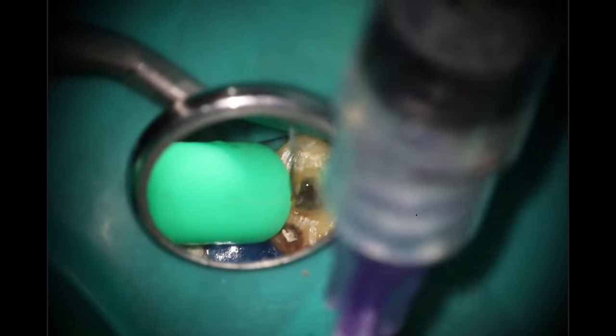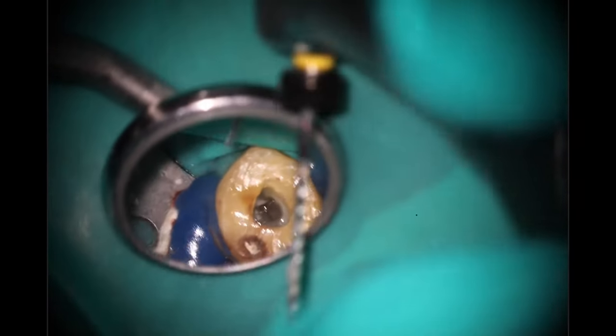And what we're going to do is start going back down that MB2, seeing if maybe my 2006 opened it up enough. Unfortunately, I'm still hitting a wall — it's not going down to where it needs to be. You'll notice I don't really have to measure with my rotary files at this point — I've used them long enough. I know the stopper is at 1.5, so that's a 19.5 as far as the length, and you have those other hash marks on there. Shout out to Dr. Raylan Wong at UOP.